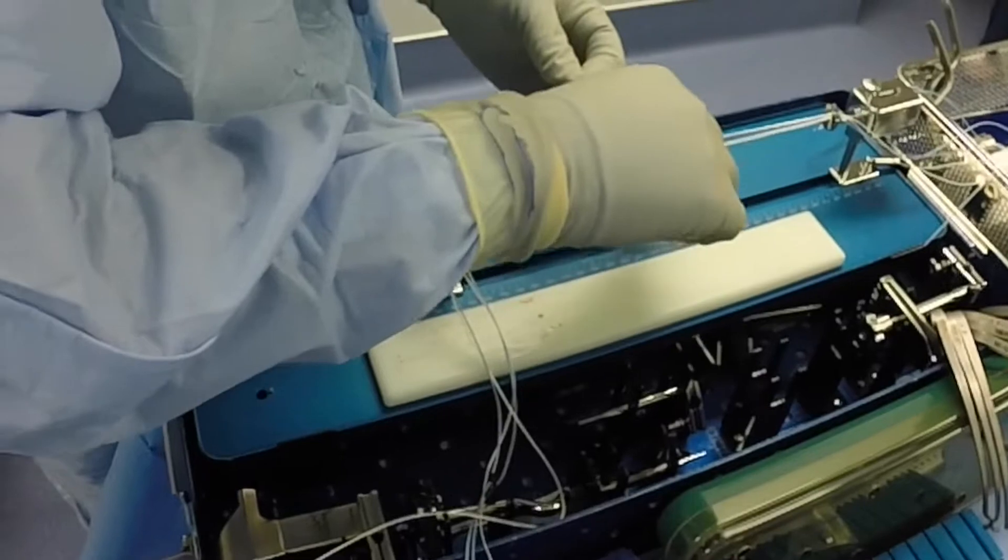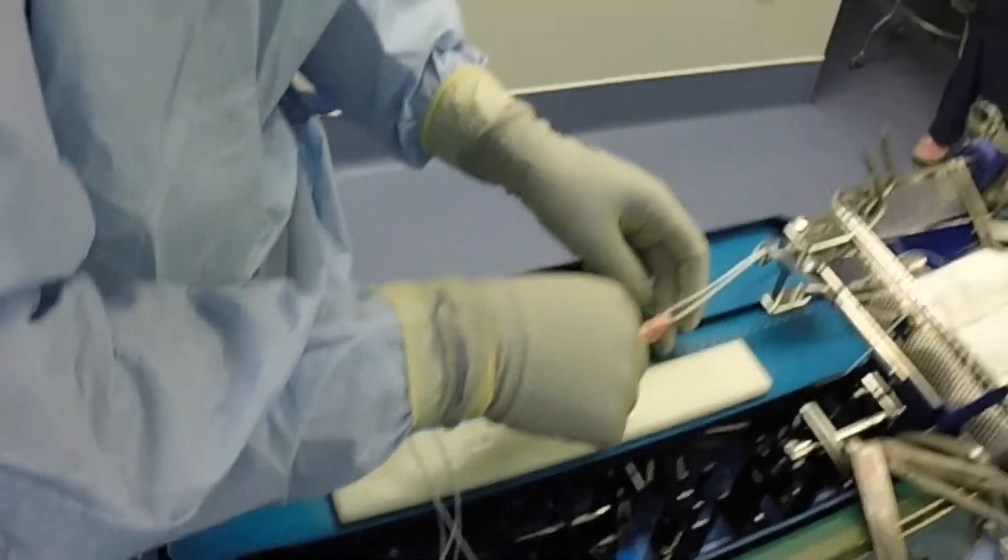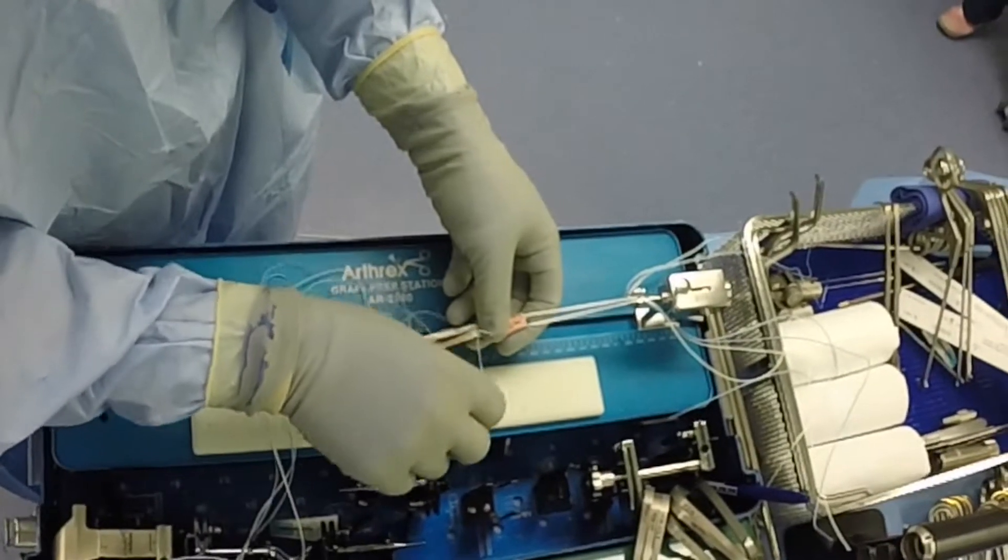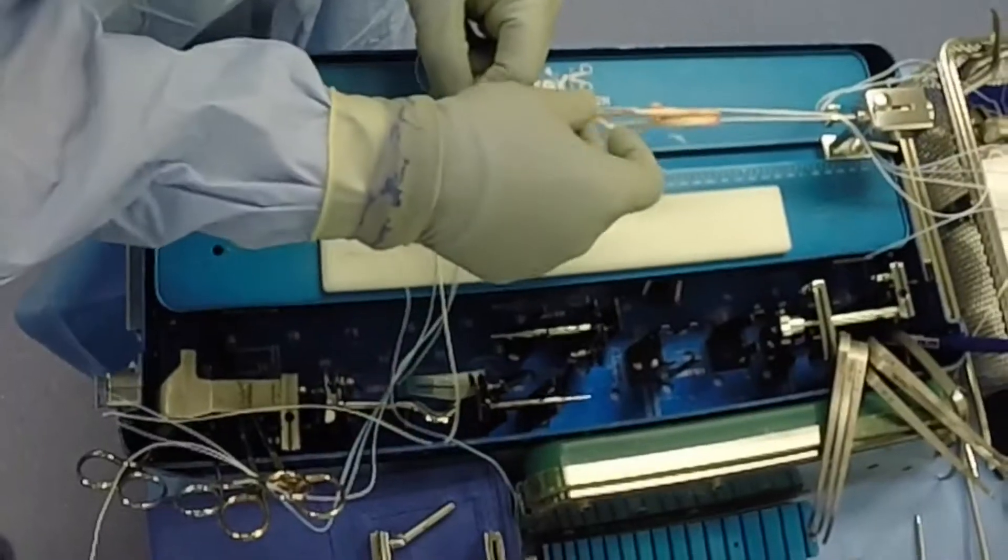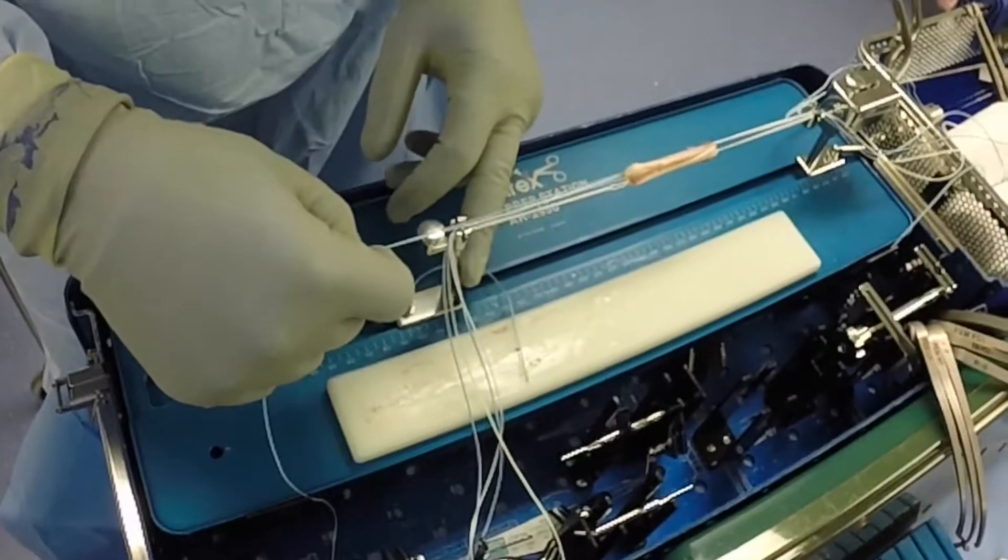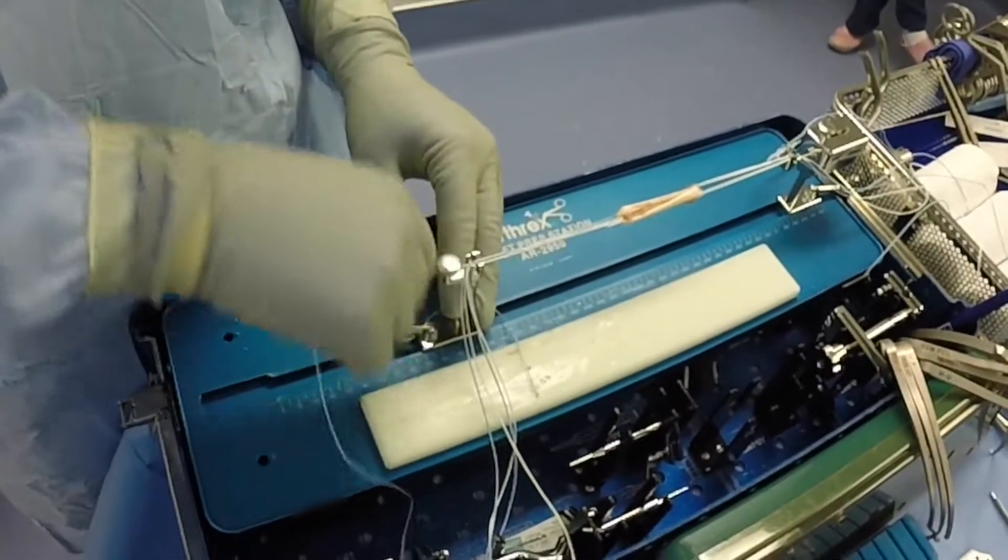The doubled-over graft is then passed through that TightRope to quadruple the graft. The tails of the fiber loop suture are then passed through the center of the two tails, one strand exiting each side, in order to dock the quadruple tendon centrally within the graft and secured.